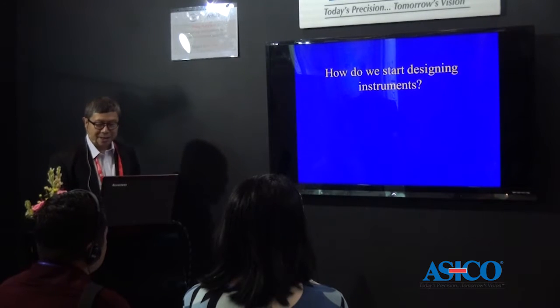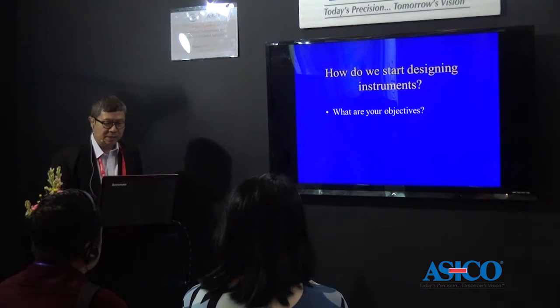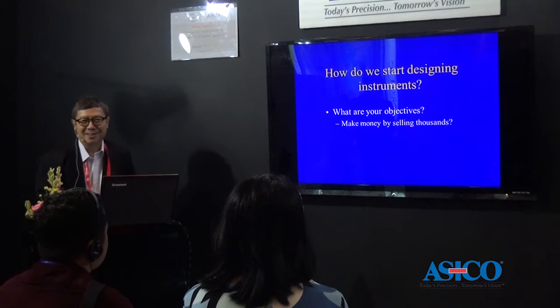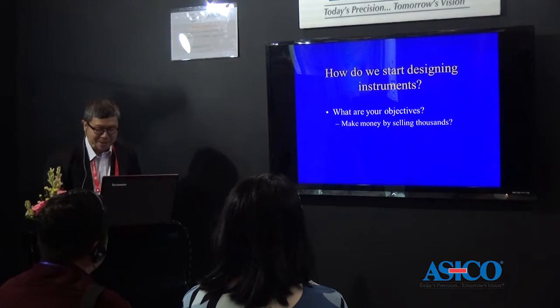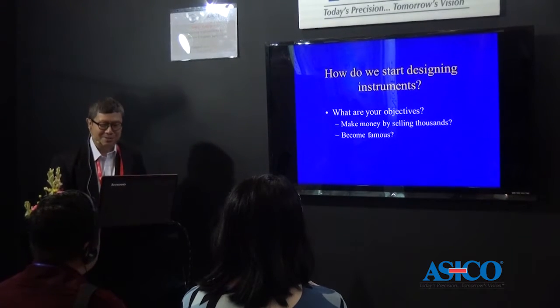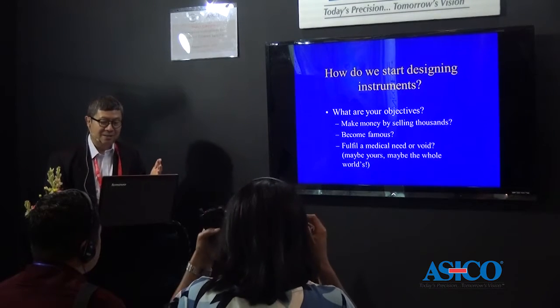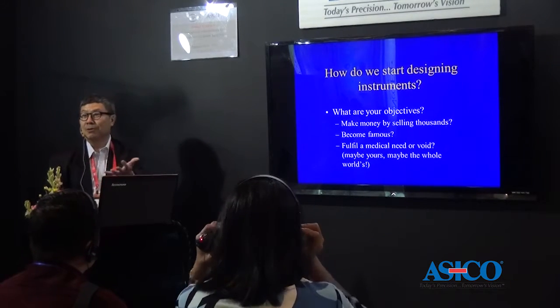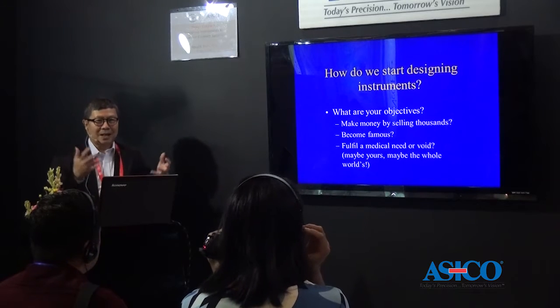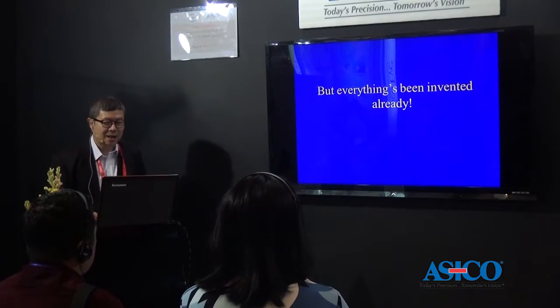So how do we start designing surgical instruments? Or should I say, what should your objectives be? Are you going to try and make money, sell thousands of instruments and become a millionaire? Not so easy, huh? Maybe you'll become famous if your instrument is really popular. Or maybe you can fulfill a medical need, and usually it starts with your own need. You're doing surgery, you find, I wish I had a better instrument to do this. And that's where many ideas start from.